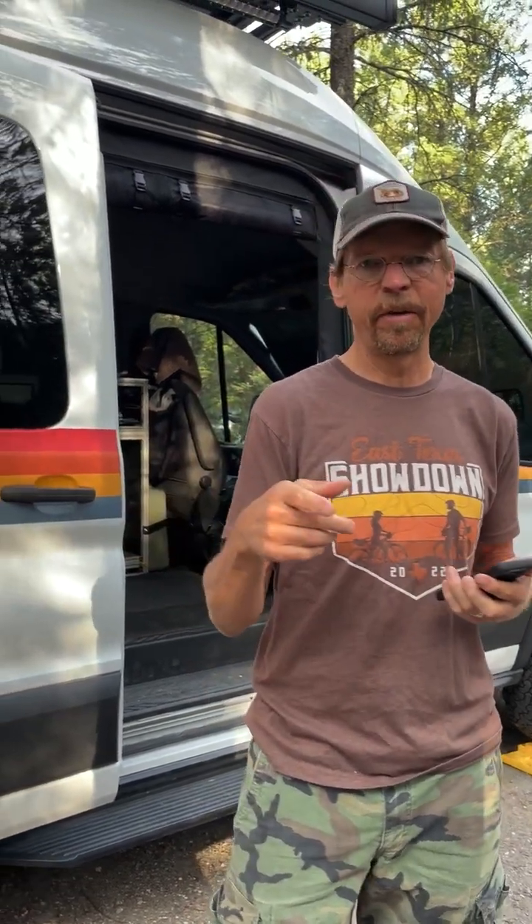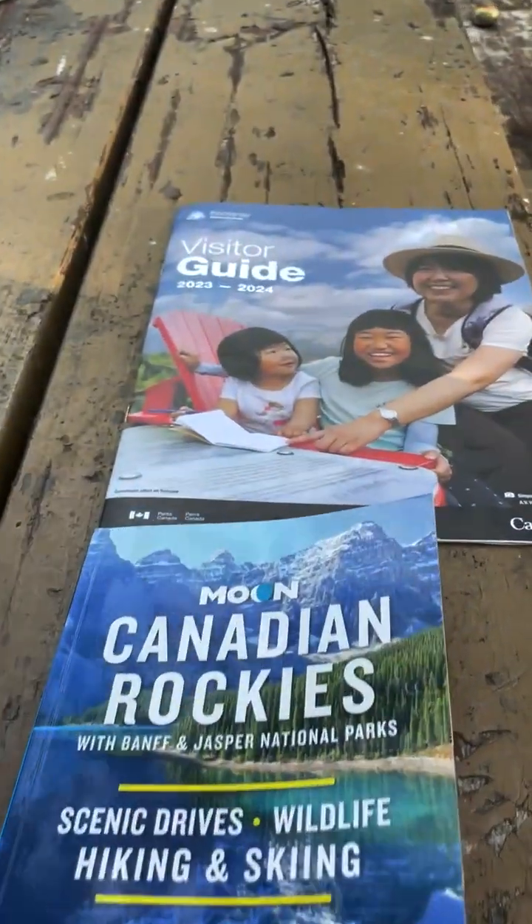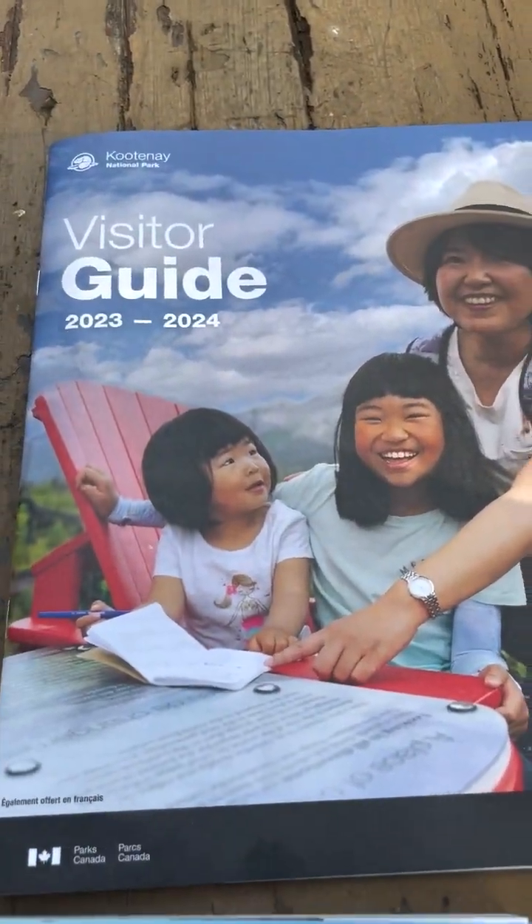I wanted to do a little video about how I change out my Omnipod and how that all works. We're actually camping right now. My wife Emily's filming this. We're at the Kootenay National Park in British Columbia, Canada.